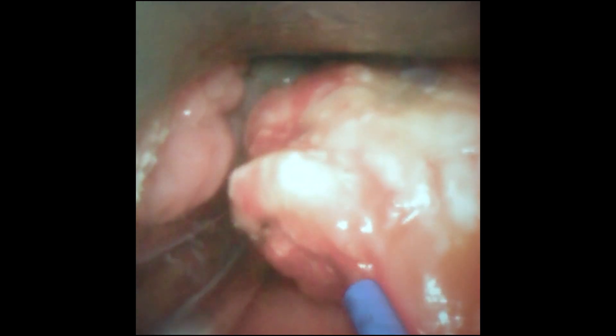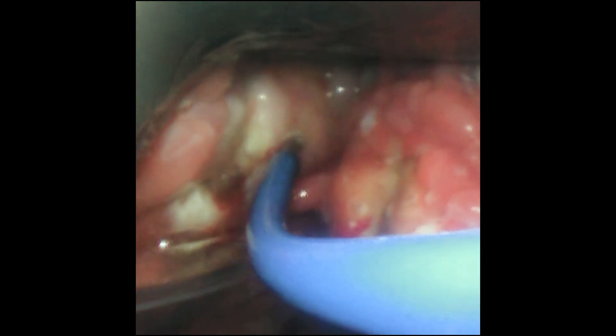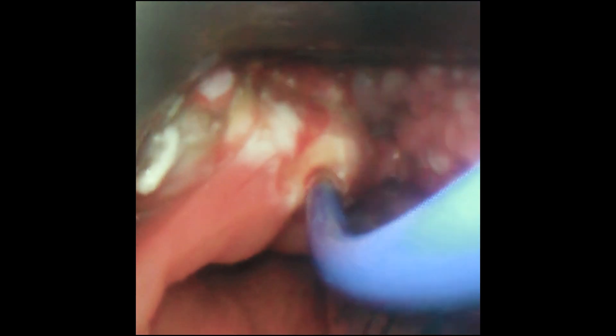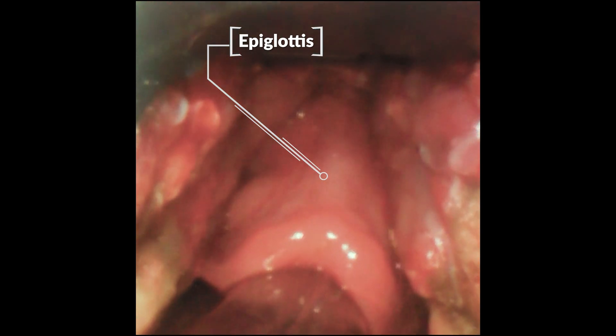Most people only notice a mild sore throat for a few days. Some people will also have a distortion of their taste sensation for approximately three weeks before it goes back to normal again. Some people also notice a feeling of a lump on the back of the throat, as there is an initial swelling — again, this slowly resolves over the next few weeks. You will see here that there is already a little improvement in the airway even after a few minutes of doing this operation. Most of the improvement is seen in about six to twelve weeks after the operation, when this tissue has slowly shrunk down.